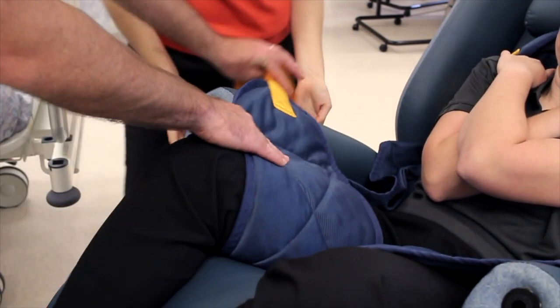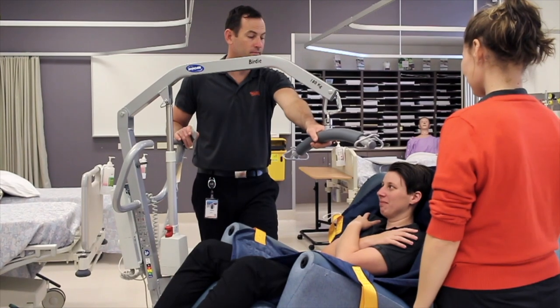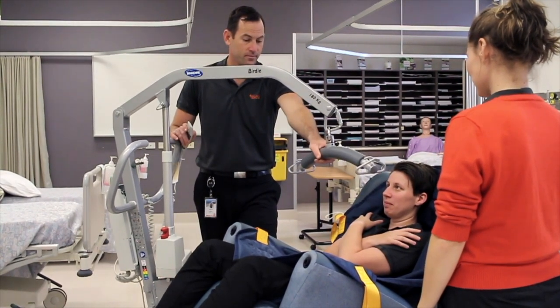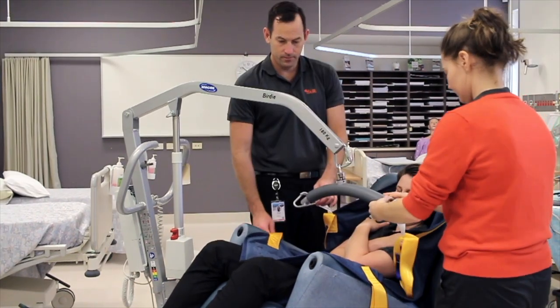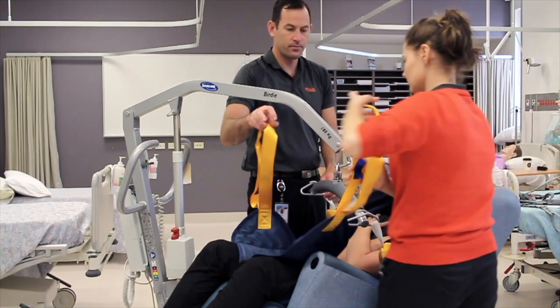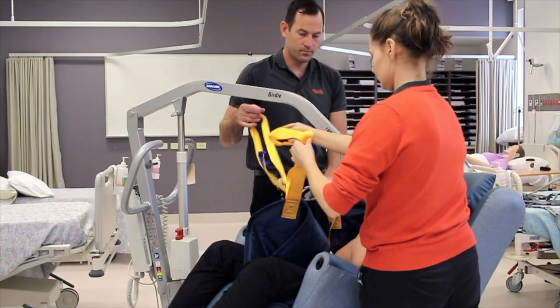The hoist is then positioned close to the resident with both legs to one side or the other of the mast and the boom is lowered. The shoulders are connected first, and if going from a seated position or into a seated position, we connect the shorter shoulder length loops to the yoke frame.